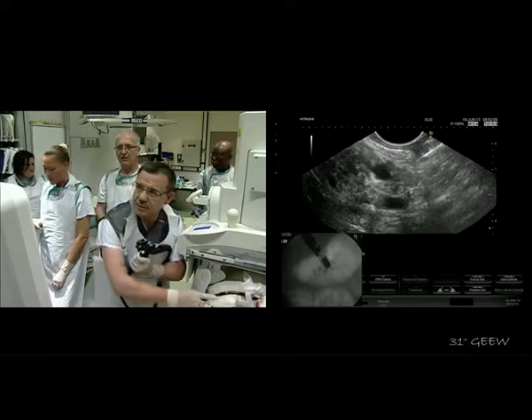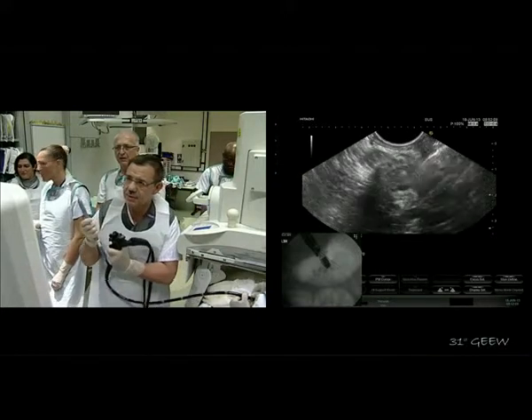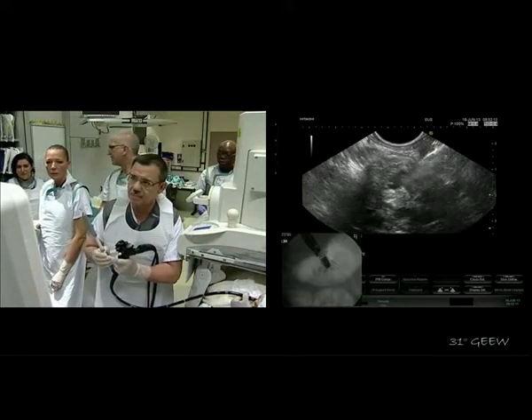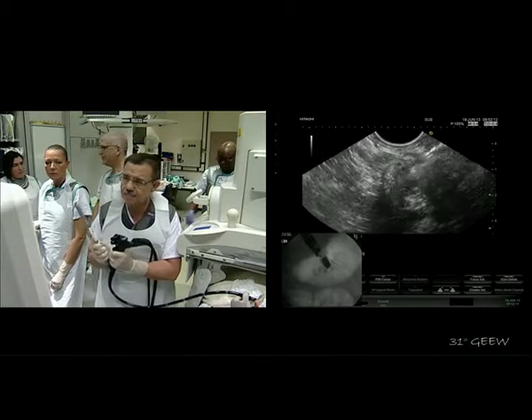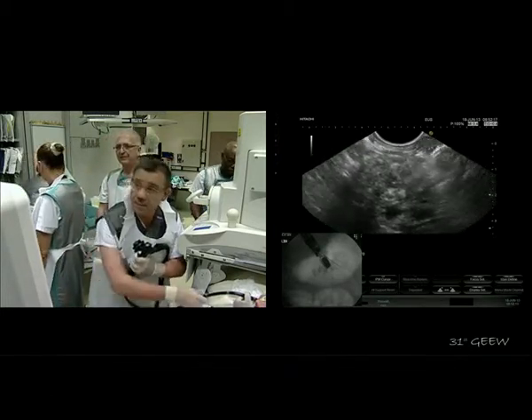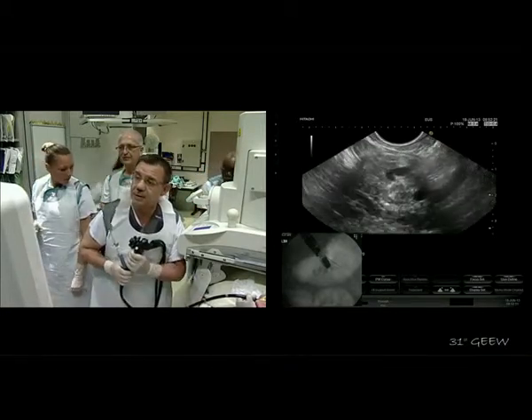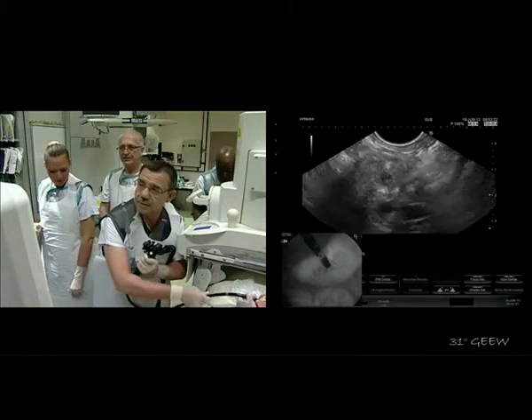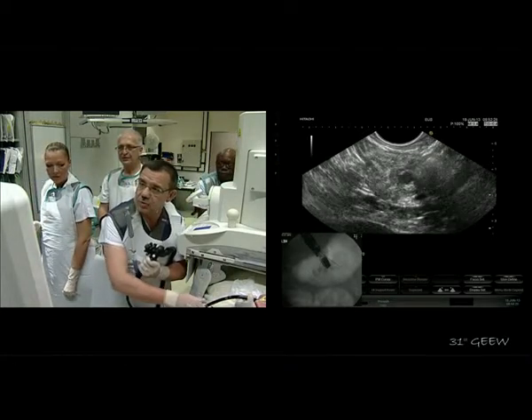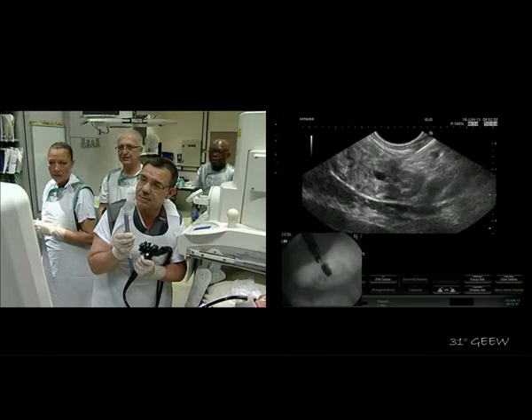You can see very well the tip. A new 19 gauge, if you want, you can have a new needle, because this one is probably not straight anymore.